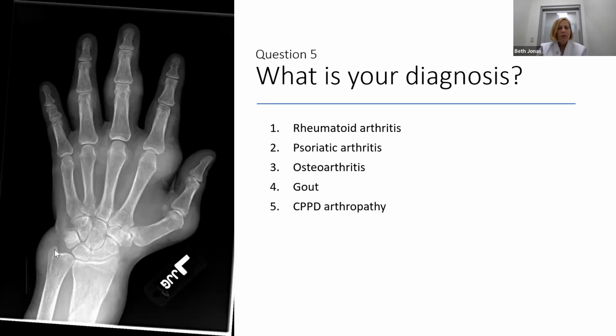We've got swelling over the ulnar styloid, there's probably a bump here over the radius, over the thumb, the second MCP, a couple of PIPs. And this has become calcified. And so these are tophi, and this patient has gout. This can't really be rheumatoid arthritis. MCP joint widths are preserved, PIP joint widths are preserved.